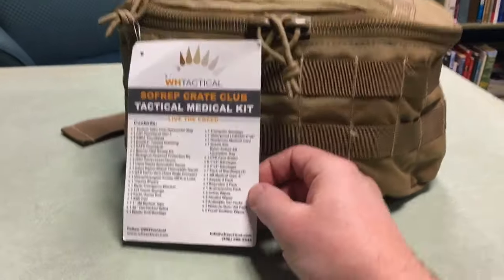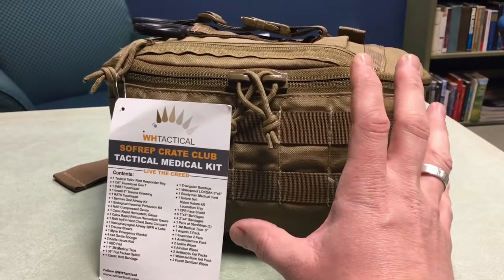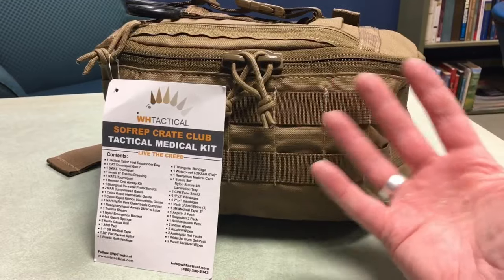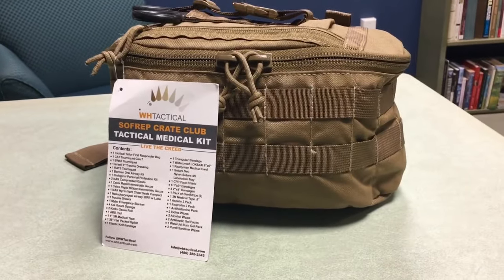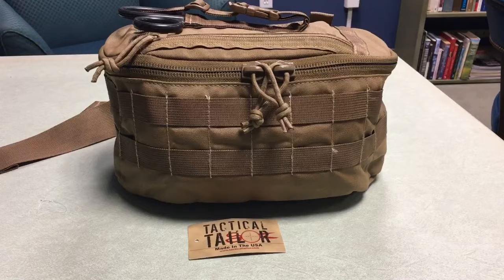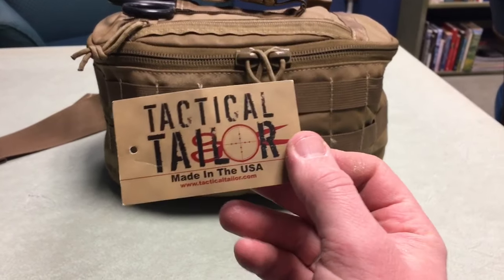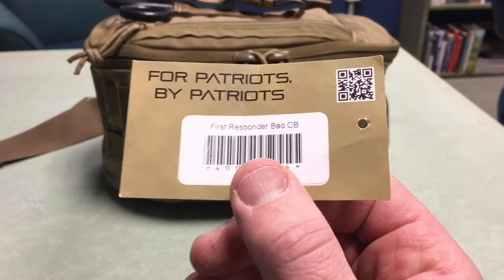You have all this gear in this kit and I usually like to keep all my gear in kits unused and unopened if I can, but with a med kit you should definitely open it up and get familiar with the items. Let's talk about the bag a little bit here from Tactical Tailor, and then we'll take a look at what's actually in the kit. The label says Tactical Tailor, made in the USA, and on the back: for Patriots by Patriots.